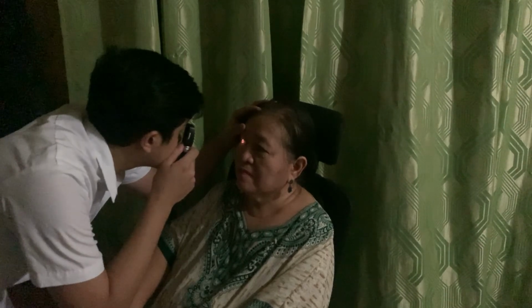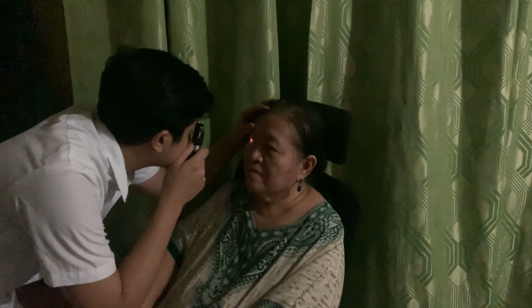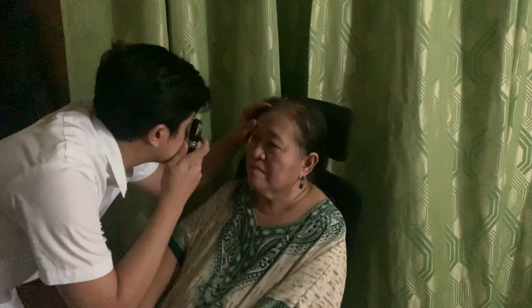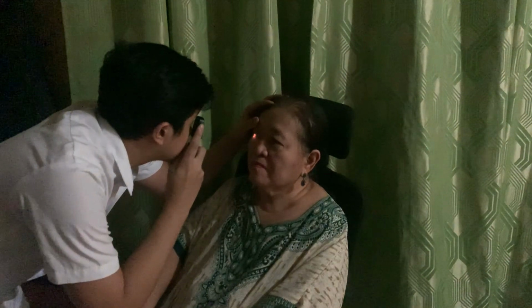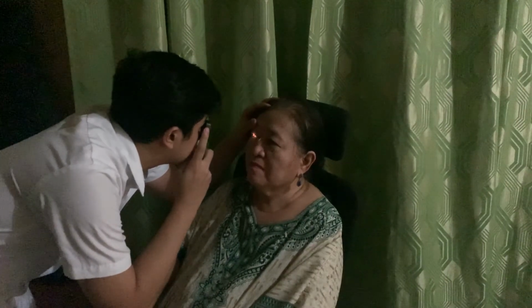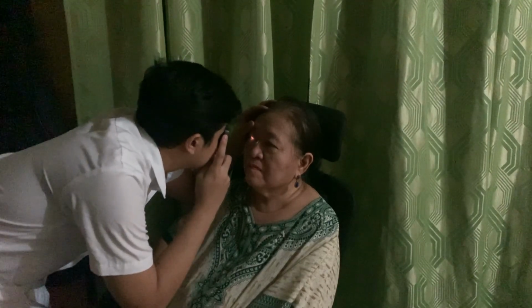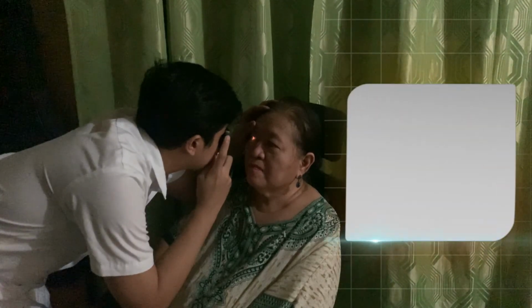From an angle of about 15 to 20 degrees lateral to the patient's line of vision, shine the ophthalmoscope towards the pupil of the right eye and look through the ophthalmoscope's viewing hole. Note the orange glow in the pupil, the red reflex, and check for opacities blocking the red reflex. Move closer to the patient's eye while slowly rotating the adjustment wheel of the ophthalmoscope using the index finger up or down until the structures become clear.